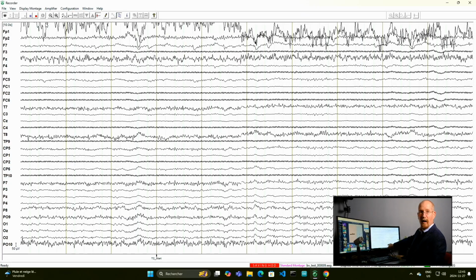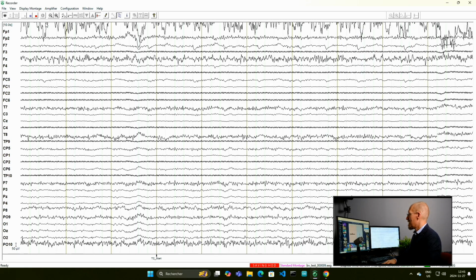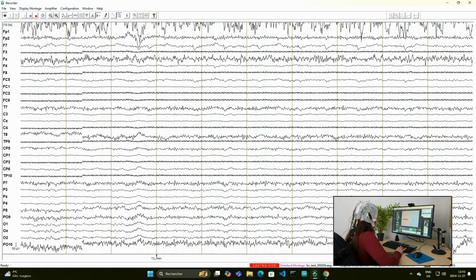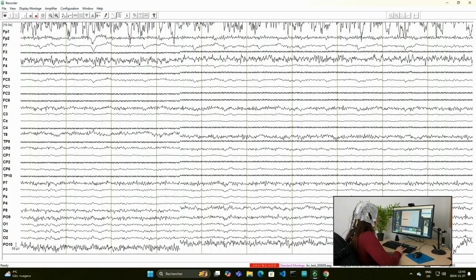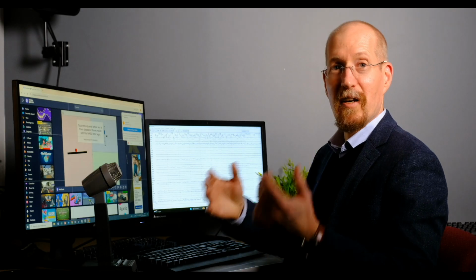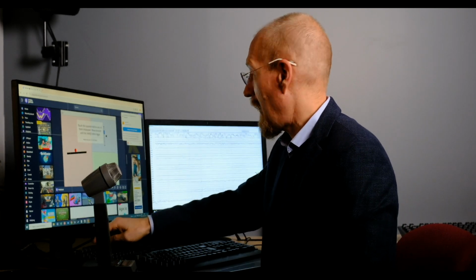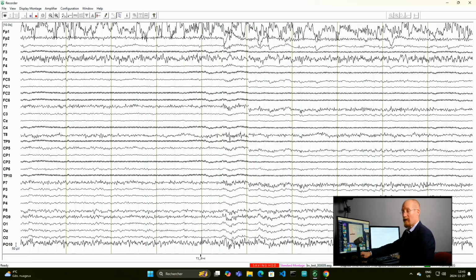So I've entered my start for task 2, and Anne is going to try to keep both these things in equilibrium. So far, so good. Excellent. Now, as you can see, the state is increased in complexity even further. I'm going to add an end marker here.